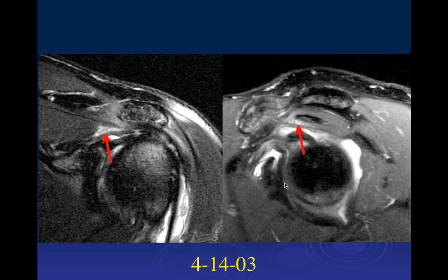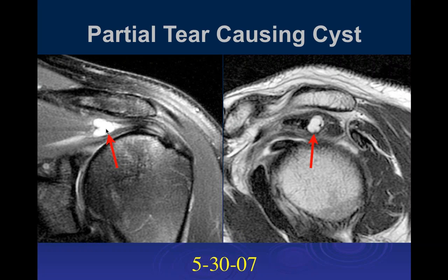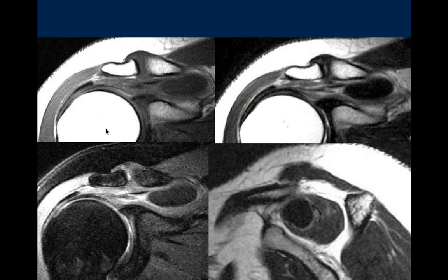So you call it an intramuscular cyst with a tear, or is it? I call it intramuscular tears, okay. You just need to describe it, make sure that the surgeon knows that you're dealing with a tear that most likely is longitudinal inside the tendon, which communicates with the joint space, and then it's causing a collection of fluid, which with increased pressure dissects into the muscle. I think that's what's occurring here. And obviously, they can be symptomatic for that. Okay.